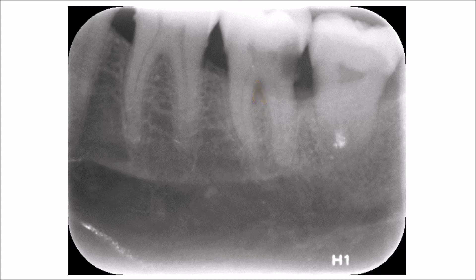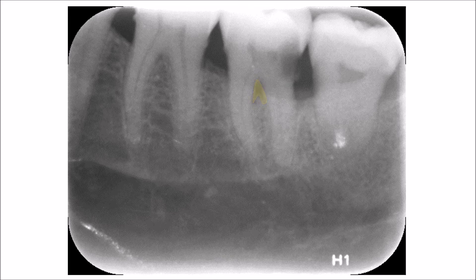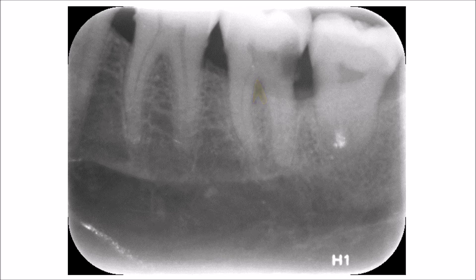If you look at the bifurcation of the lower six, you will see that you cannot detect a radiolucency there, which means that at the time this radiograph was taken, the bifurcation is still intact. We cannot tell whether in the coming days, weeks, or months — depending on the activity of the periodontal disease — this area will be affected or not.